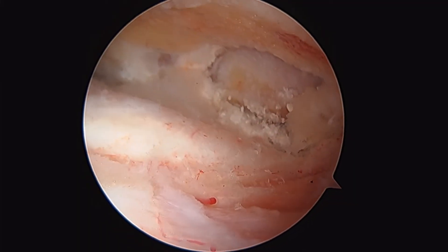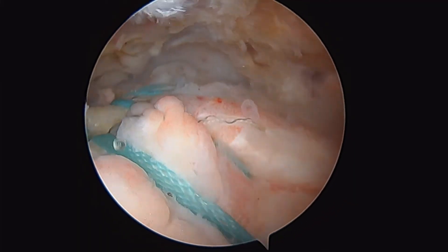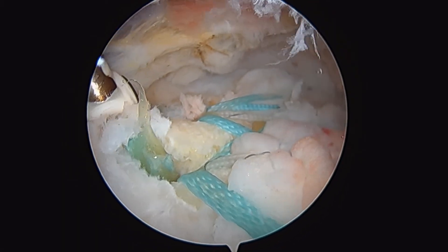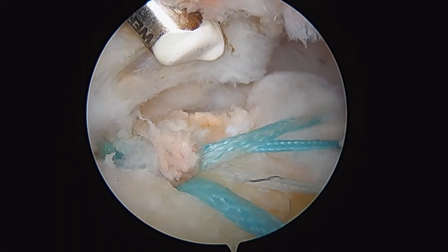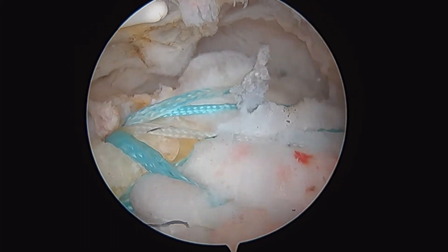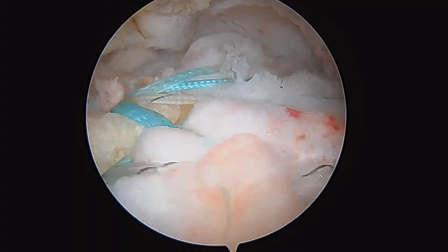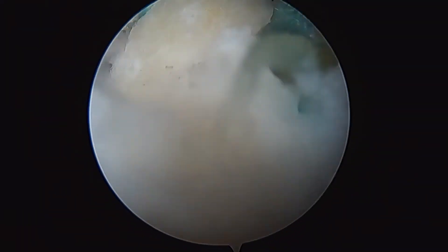Final look at our repair. Normal cuff here. These are all of our sutures. There's our posterior lateral row anchor there, and then there's our more anterior lateral row here. All of our sutures coming down. We didn't use any knots. I'll just take the scope out of the shoulder here and put it in laterally for you guys to see.